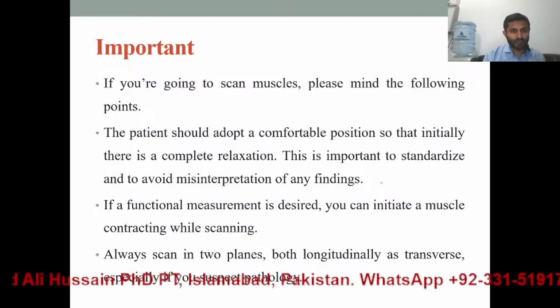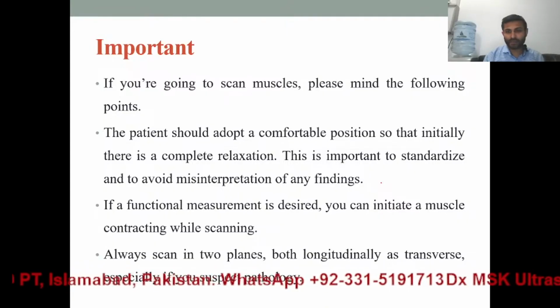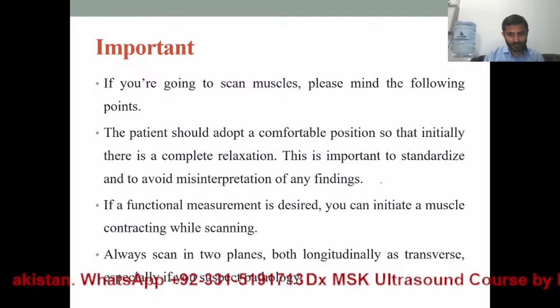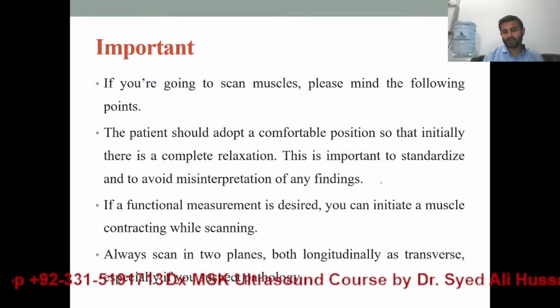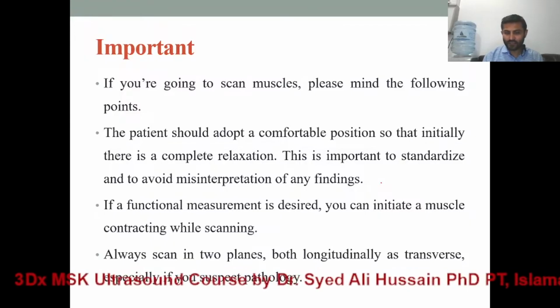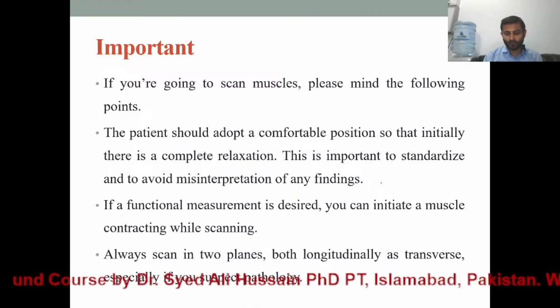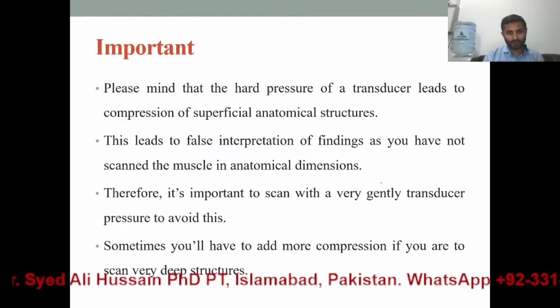Important, if you are going to scan the muscles, please mind the following points. The patient should adopt a comfortable position so that initially there is a complete relaxation. This is important to standardize and to avoid misinterpretation of any findings. If a functional measurement is desired, you can initiate a muscle contraction while scanning. Always scan in two planes, both long axis and short axis, if you suspect pathology.